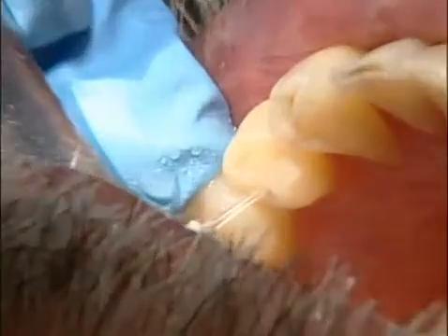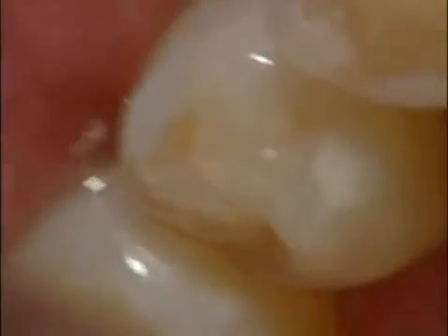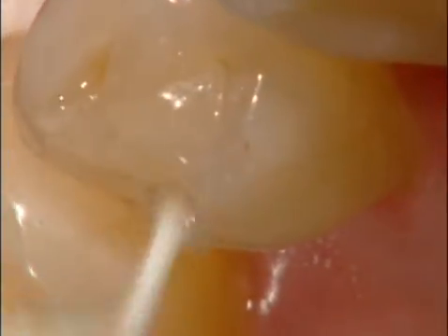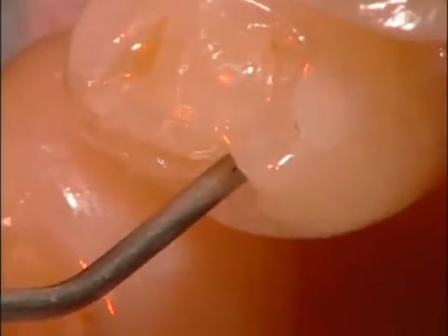So I'm doing a class 2 tunnel prep on this patient. Again, the whole purpose is to access the decay and remove it. I want to maintain as much of the marginal ridge as possible. So I can take the laser, I can go in, remove the decay, take the T4 tapered tip, typically lowering the power down to 2.5 to 4 watts, and remove the interproximal decay. Then I can go in, place my glass ionomer lining to remineralize the interproximal enamel. Put a flowable composite in or my regular packable composite.